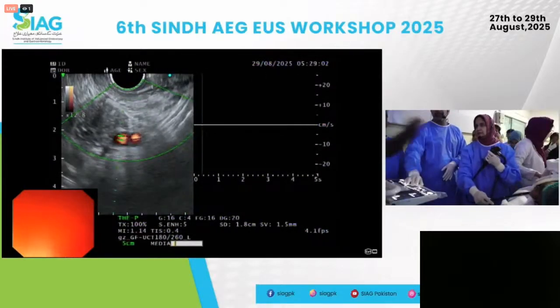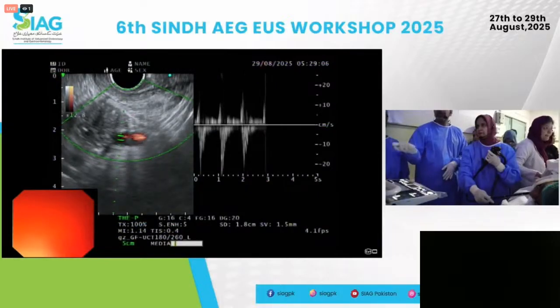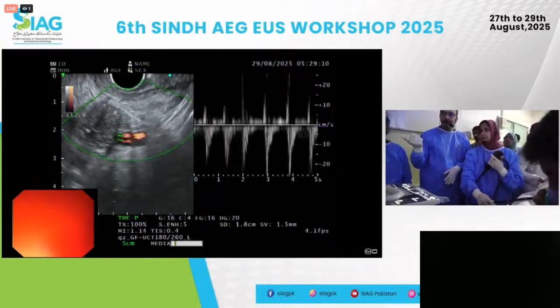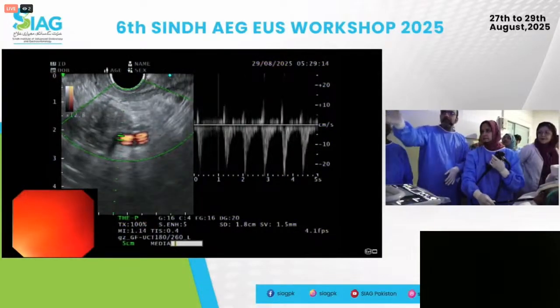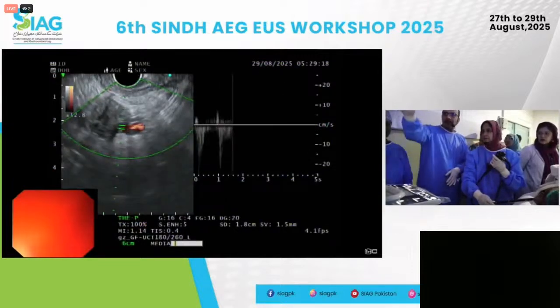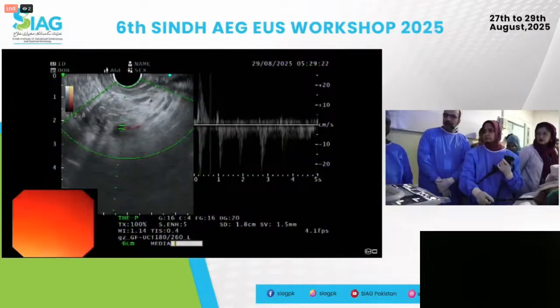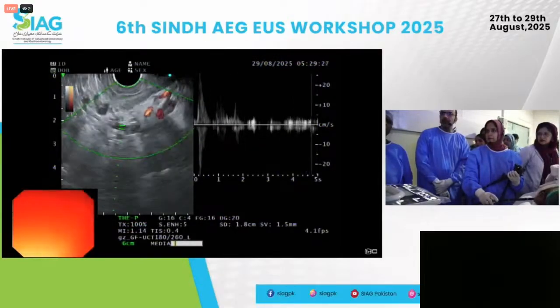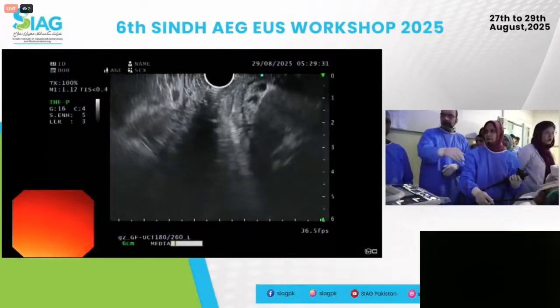Sorry. No, you're fine. I'll stay here. So what is this? Arterial, most likely. So which artery? Splenic. Good. Keep going clockwise for a sec. Firstly, if you see splenic artery, the next thing is if that's pancreas, we would expect to see the vein. Keep going counterclockwise. That's okay. You're fine. Let me take over just for a second to demonstrate this.